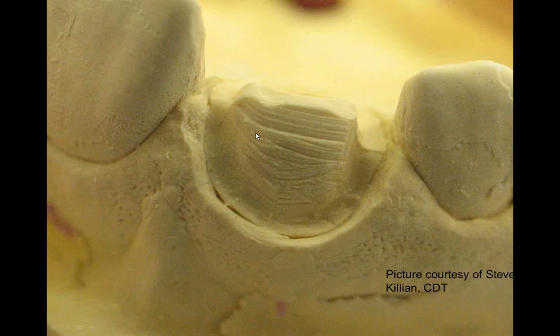Here we are. Well, other than looking a little squat, the margins look pretty decent. I'm a little worried about this. We've seen this before. Once again, most doctors don't grind in here and lift and then drop down the other side, so that could be problematic. But that's not even the big problem on this particular unit, this particular impression.